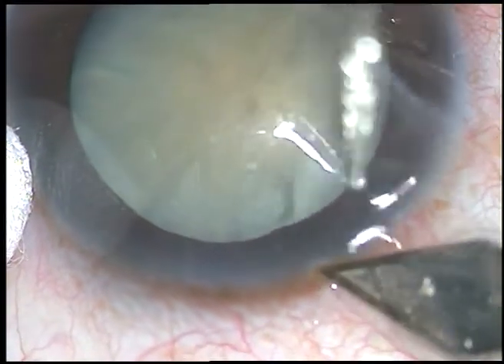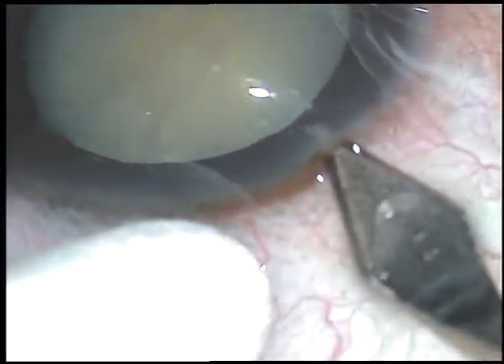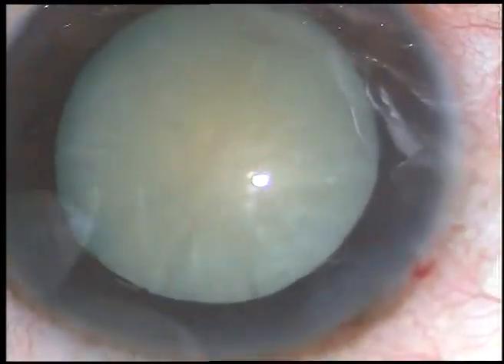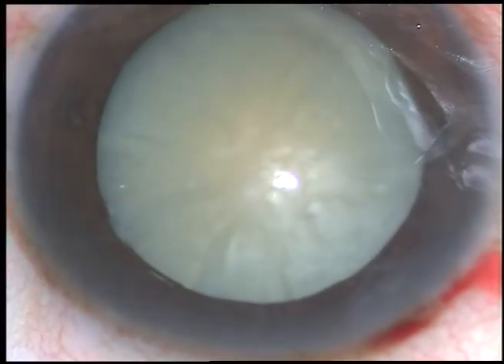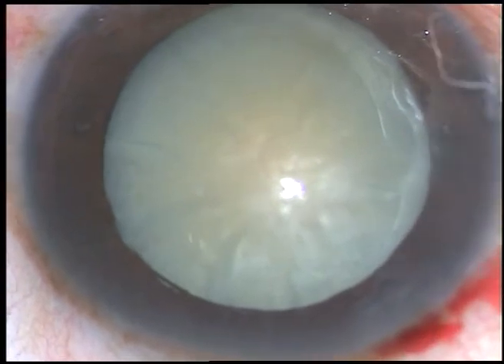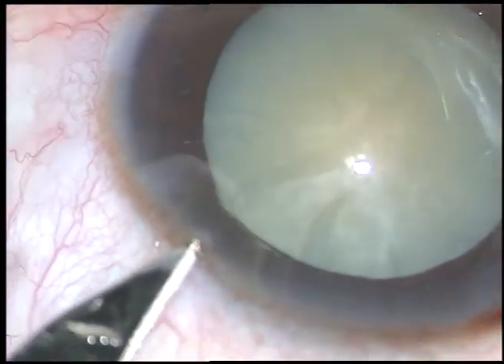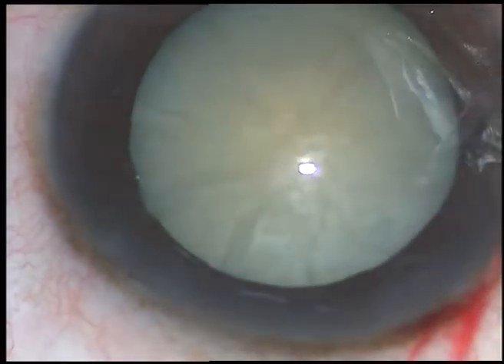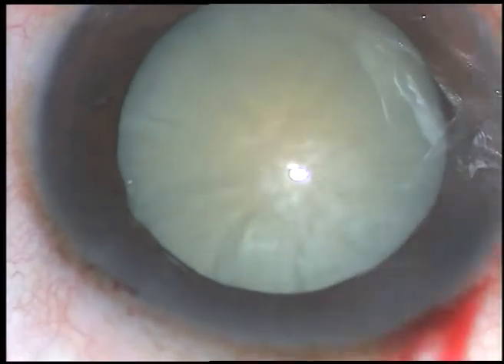Friends, capsular phimosis usually occurs if the capsulorhexis is small. In such cases, we can always enlarge the rhexis at any time — at the conclusion of surgery or at any stage of surgery.